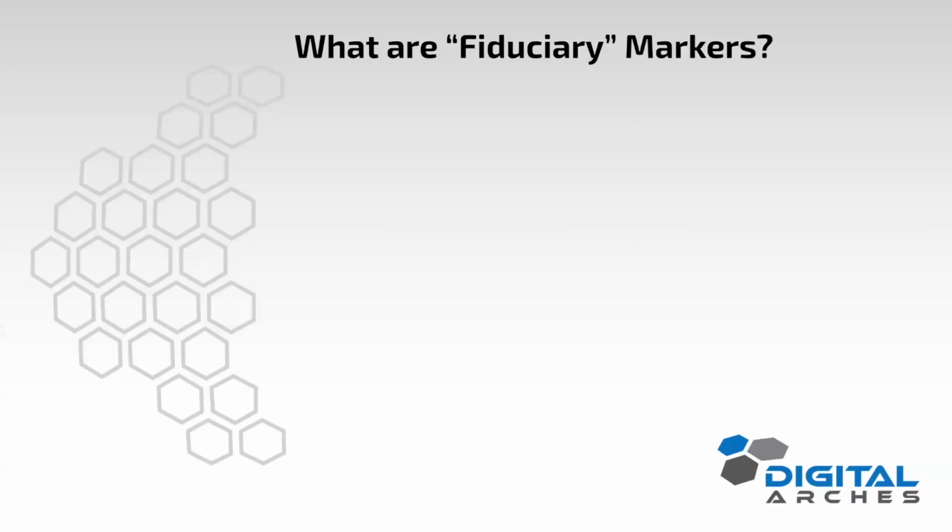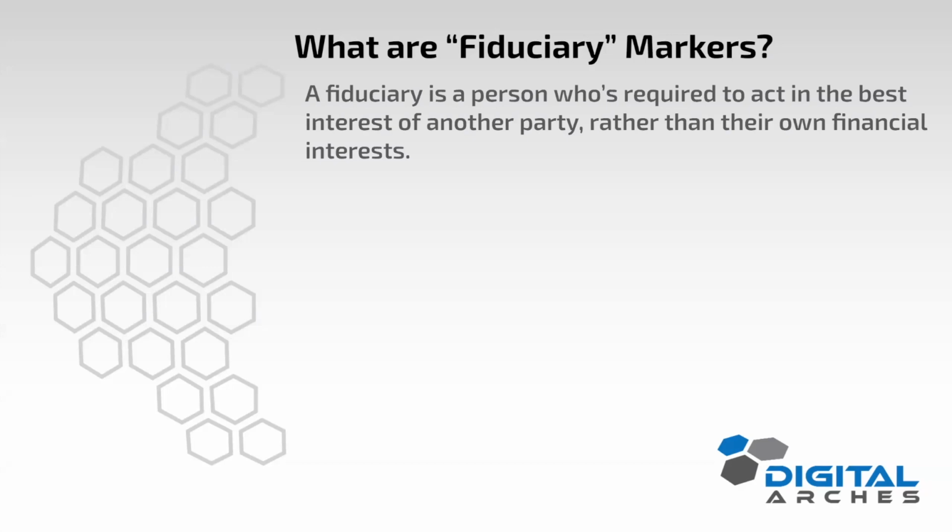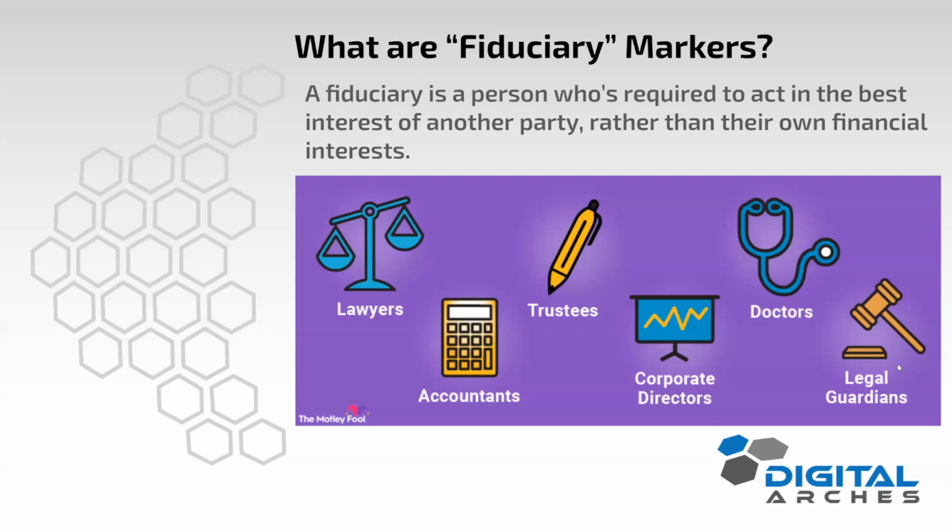So what are fiduciary markers? We will always hear this term all the time. But a fiduciary is actually a person who is required to act in the best interests of another party rather than their own financial interests. Now, does that sound anything at all like dental related?